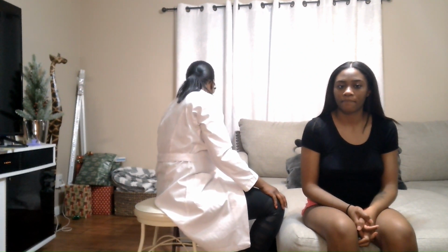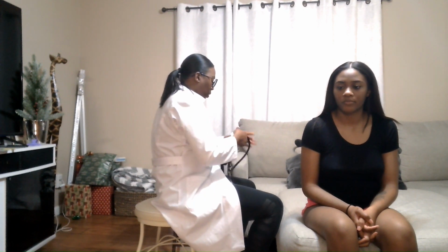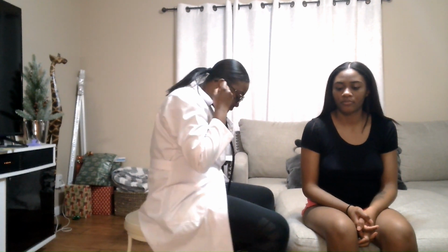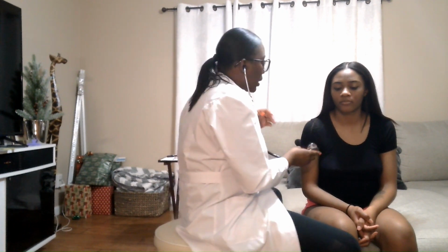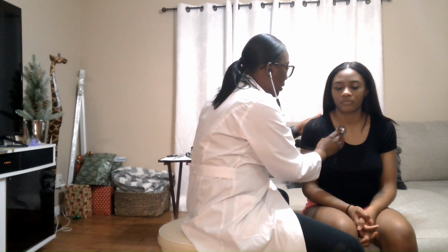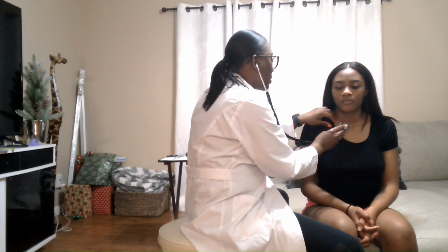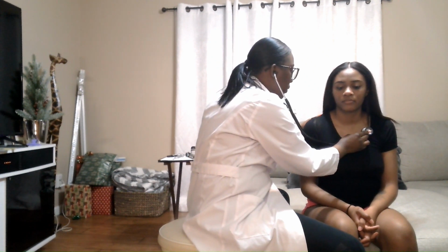Next thing I'm going to do is listen to your lung sounds. Let me get my stethoscope. I'm going to assess your lung sounds using the diaphragm of my stethoscope. I'm going to listen anteriorly first and then posteriorly. I'm going to listen at the apex of the lung. Deep breath for me. So every time I place my stethoscope, I want you to take a deep breath.